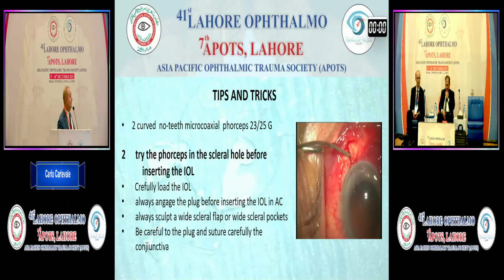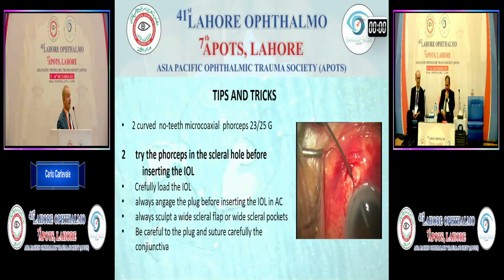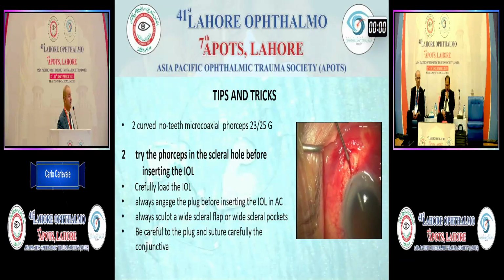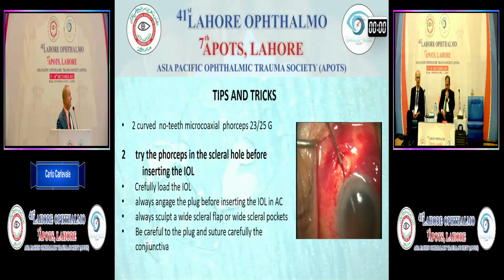Always try the forceps in the scleral hole before inserting the IOL, because during insertion of the IOL, you have 2 hands busy, so you need to know that all the way in the thickness of the sclera is smooth, and the forceps is well tested.